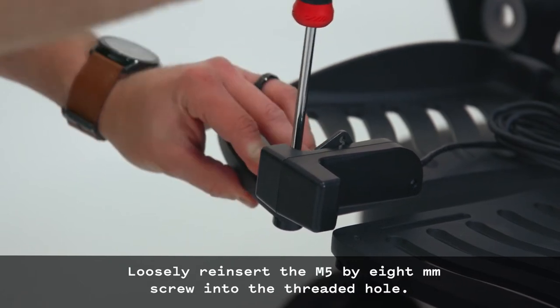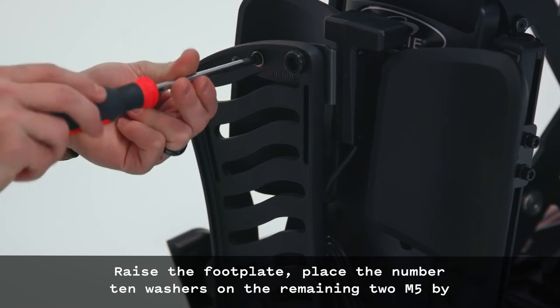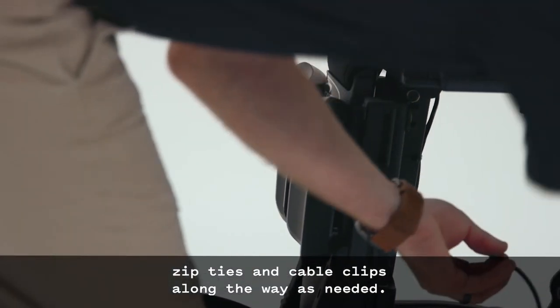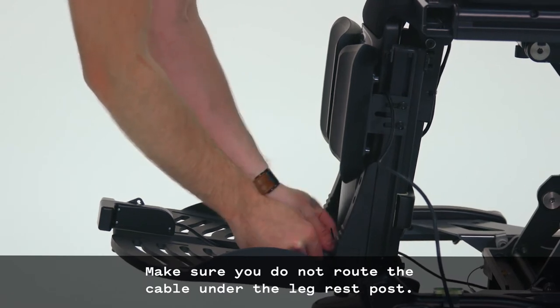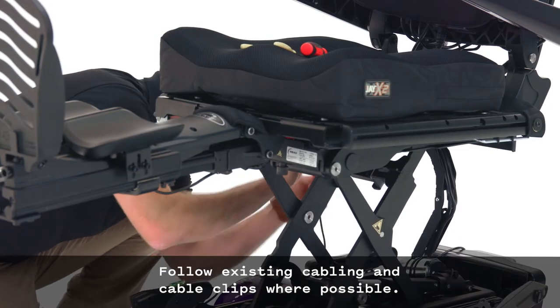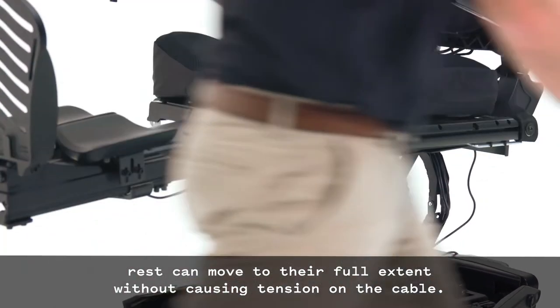Loosely reinsert the M5x8mm screw into the threaded hole. Raise the footplate, place the number 10 washers on the remaining two M5x8mm Phillips head screws, and insert them into the 5/16 inch holes from the bottom of the footplate. Tighten all three screws. Route the scout cable along the side and top of the footplate using zip ties and cable clips as needed. Before applying cable clips, thoroughly clean the plastic with an alcohol wipe. Do not route the cable under the leg rest post. Raise the leg rest to its fullest extent and continue routing the cable along the side of the leg rest toward the back of the wheelchair, following existing cabling and cable clips where possible. Ensure there is enough slack in the USB cable so that the seat and leg rest can move to their full extent without causing tension on the cable.